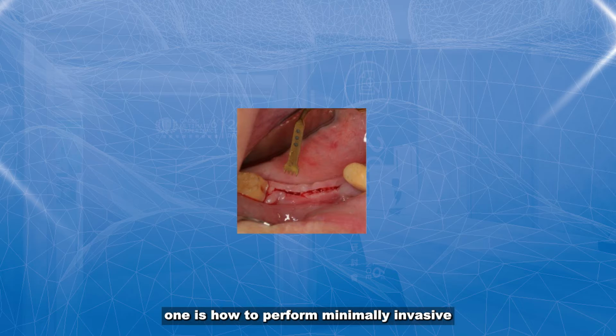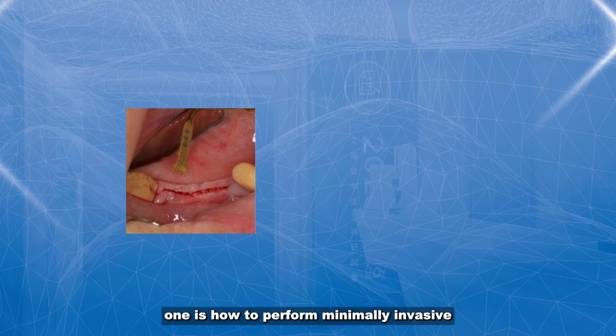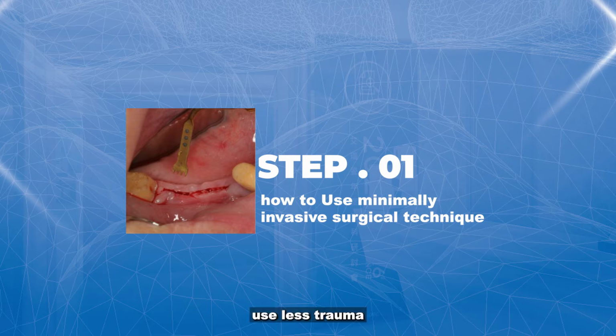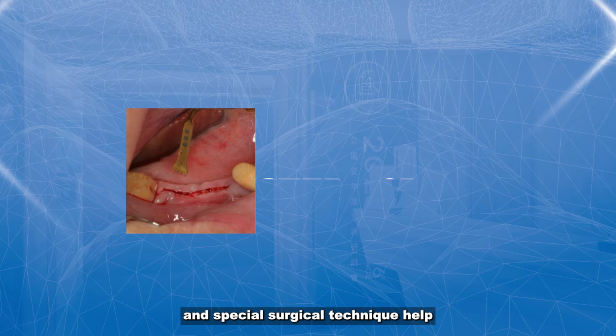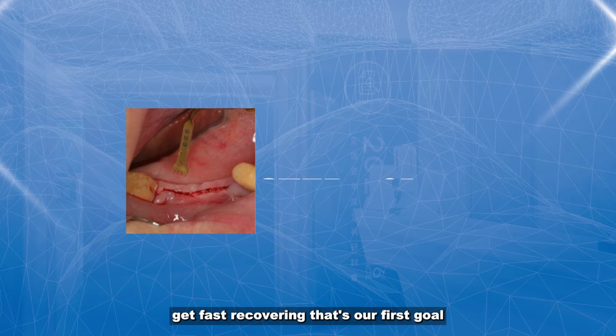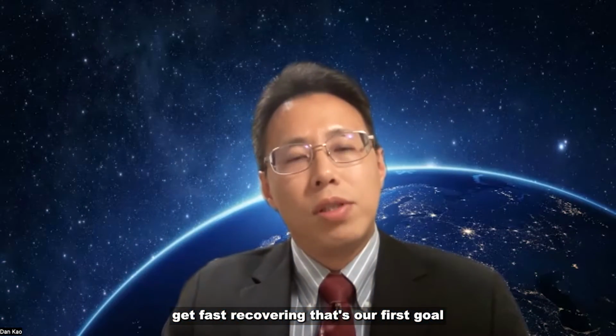Today we're gonna focus on two major topics. One is how to perform minimally invasive surgical technique. For example, how we use less trauma, the small incision, and special surgical technique to help the patient get a fast recovery. That's our first goal.